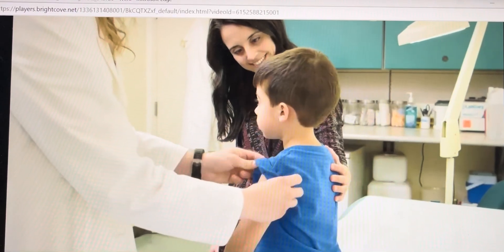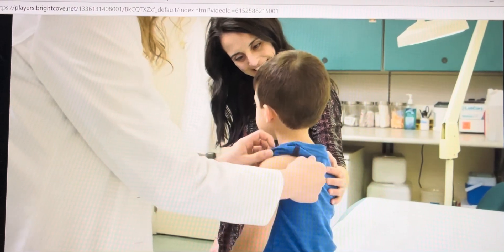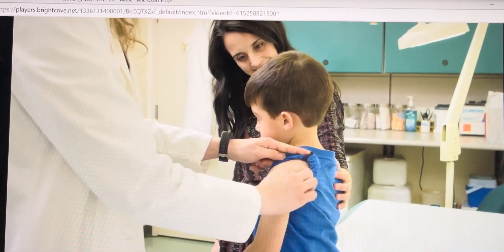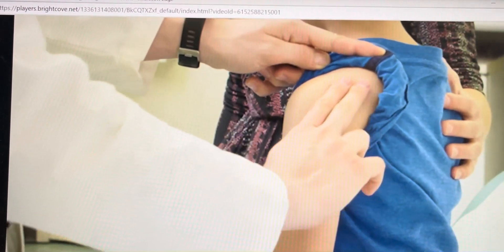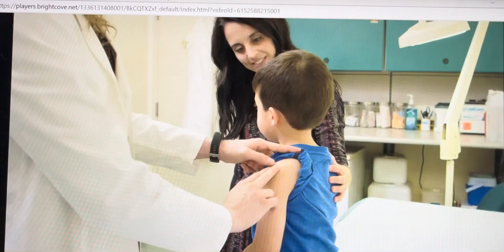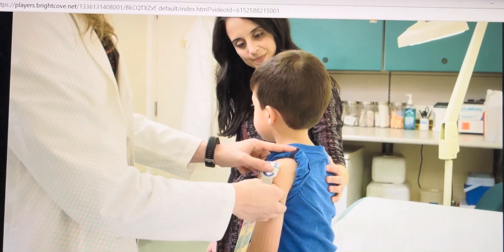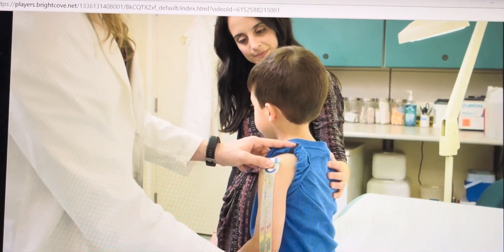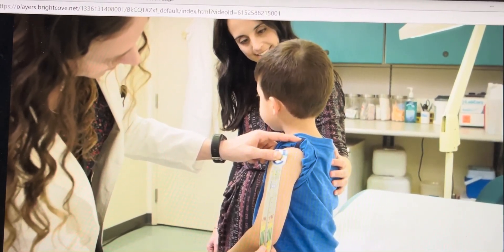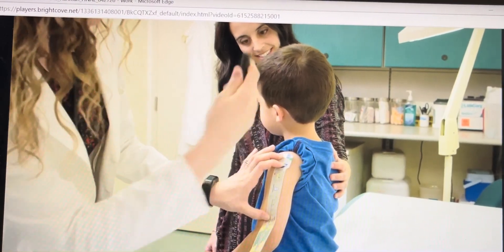Now for the measurement, which is conducted the same way for all ages. Identify the midpoint of the upper arm between the acromion and the olecranon process. Feel for the acromion at the top of the arm where the scapula meets the shoulder joint. Then look for the olecranon process at the elbow. You can also use the ruler on the device to measure and take note of the midpoint. Measure the length between these bony landmarks and mark the midpoint between them with a pen or skin marker if needed.